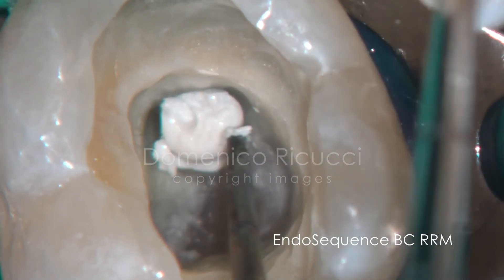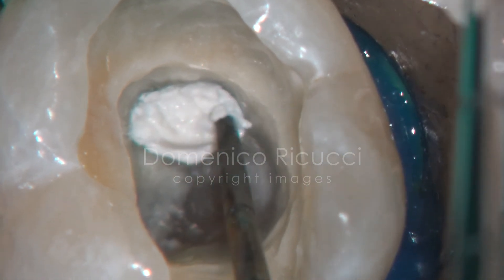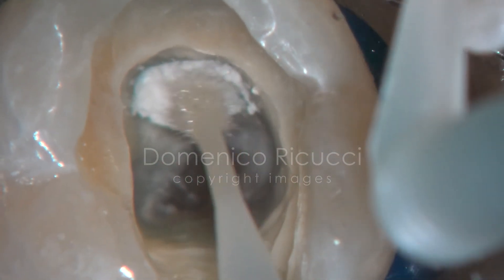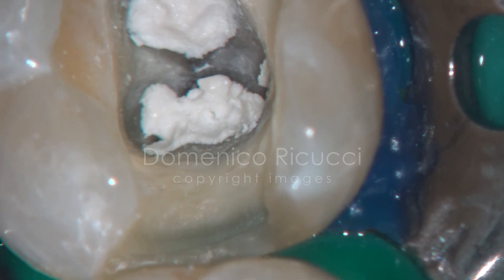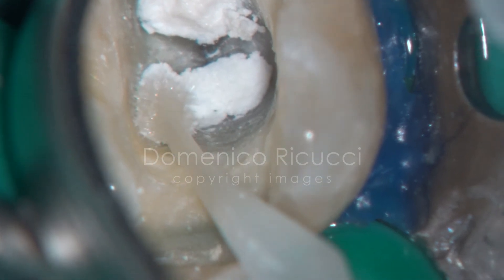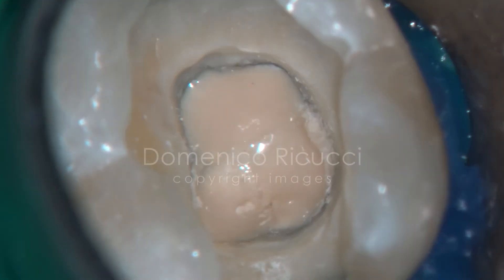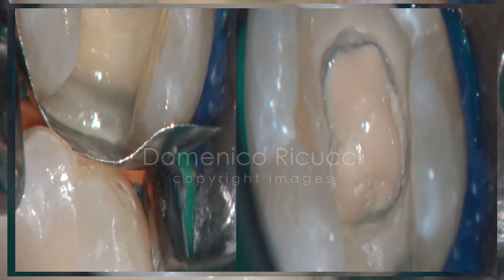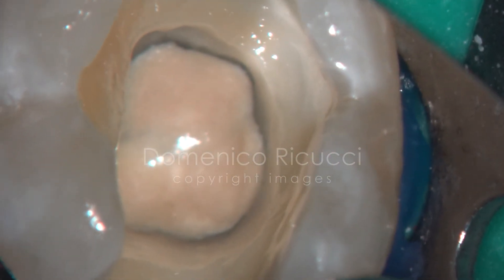The newly formed mineralized tissue is covered again with a layer of bioceramic material, blocked by a layer of Dical, and the cavity adequately restored with common adhesive technique and composite materials.